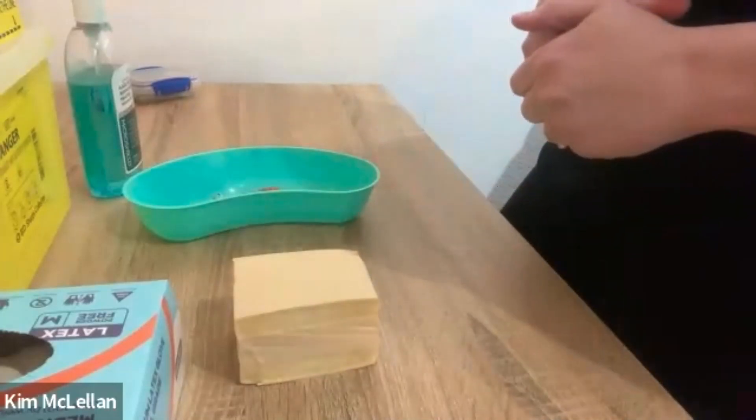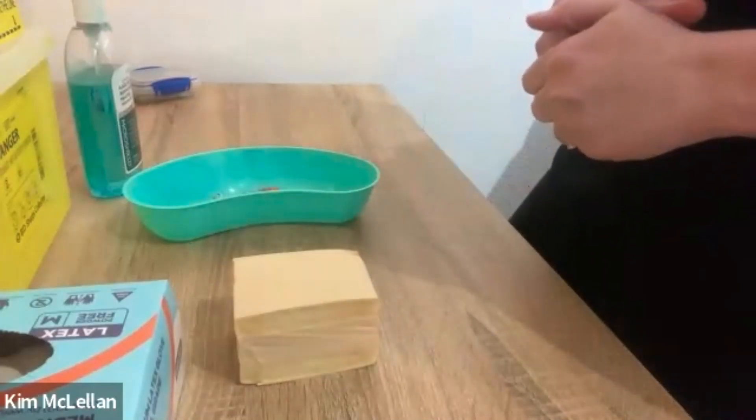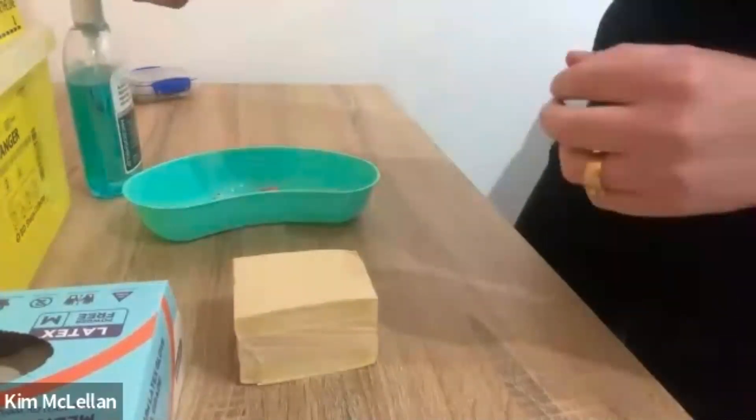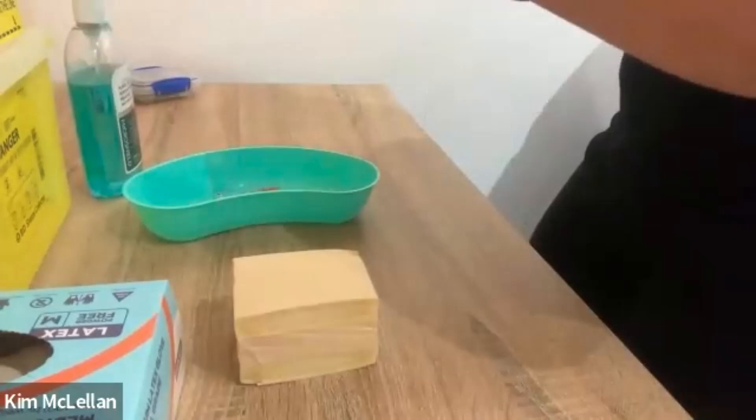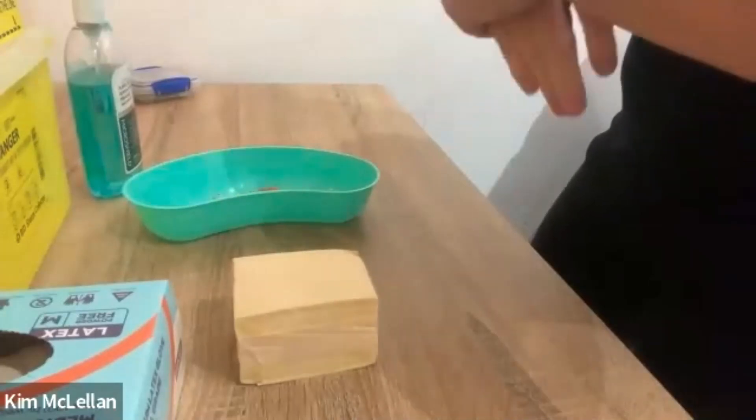Have you got any questions or concerns before I proceed? Okay, all right. Before I proceed with injecting your insulin, I'm just going to wash my hands again.